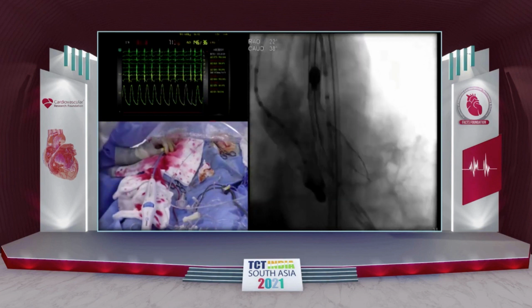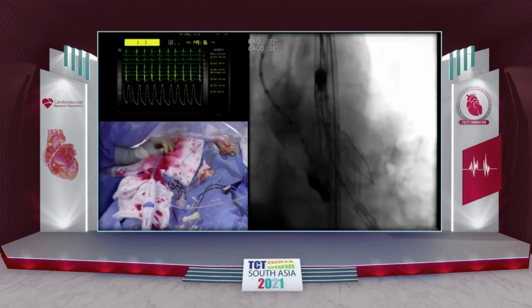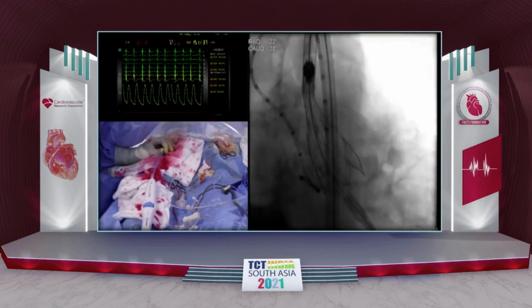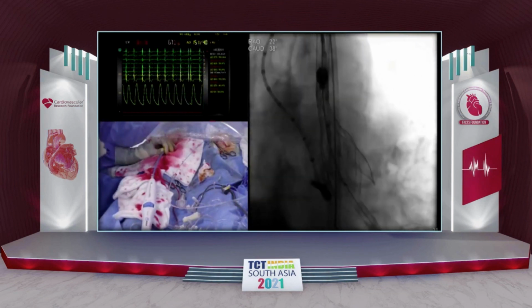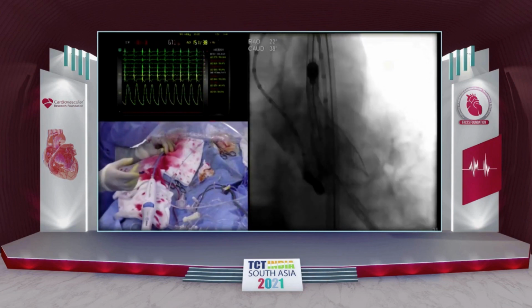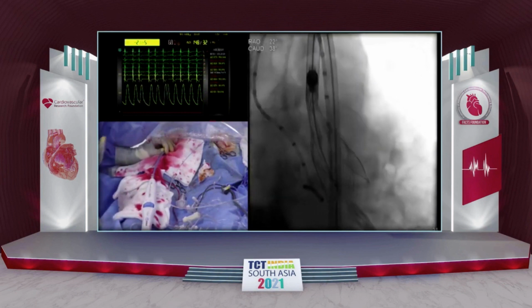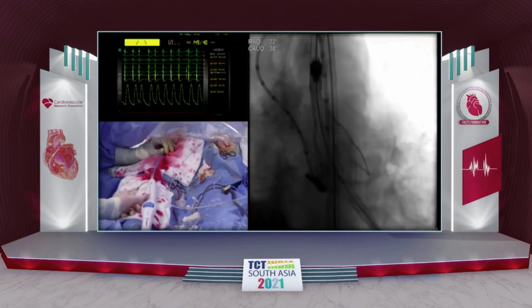For those of you who do the cusp alignment technique, when you go home tonight, try this out. Do your cusp alignment projection on the systolic image and also the diastolic CT image, and you'll see that the measurements are different, which is not rocket science because the heart does move during systole and diastole. So, okay, let's go back.